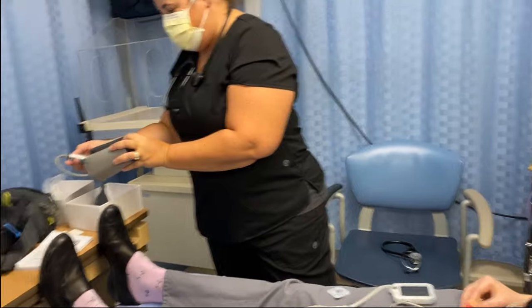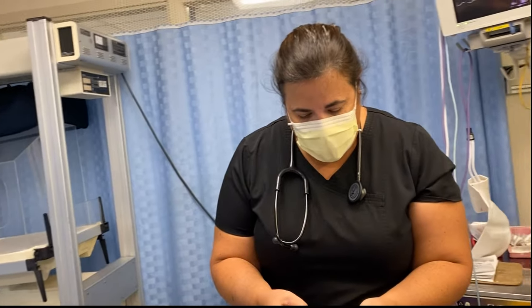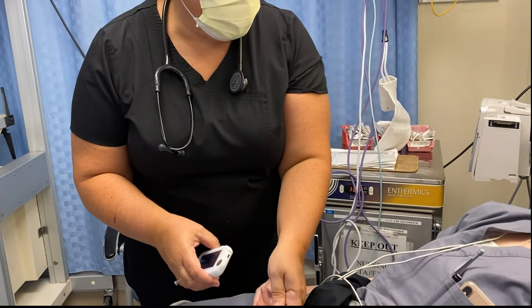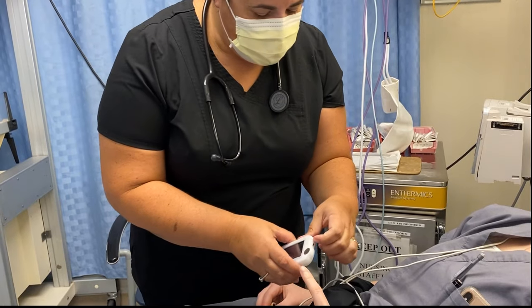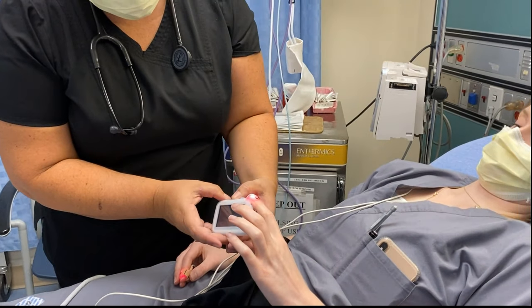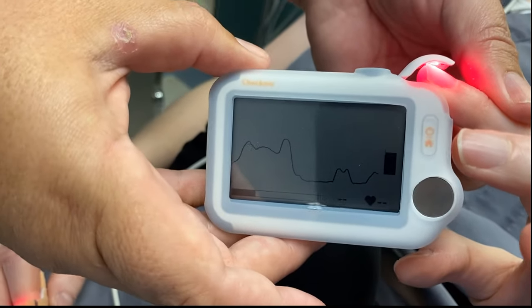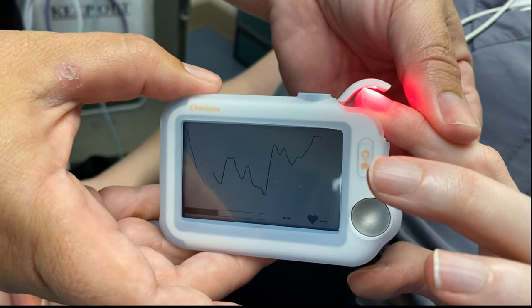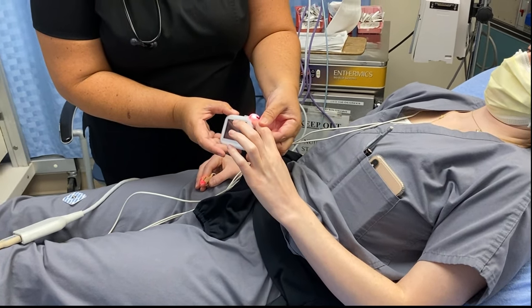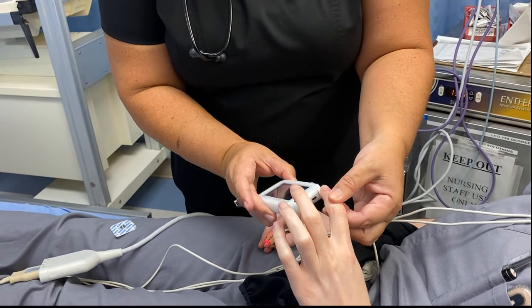Next up is pulse oximetry. The pulse is on the machine — it's 99, and 99 up there on the hospital monitor. On this machine we have two ways to do it. First, we put the finger in here until it reads — you don't want to press too hard, just set it in there. It reads until the black line goes all the way across the screen. Her sat is 98.